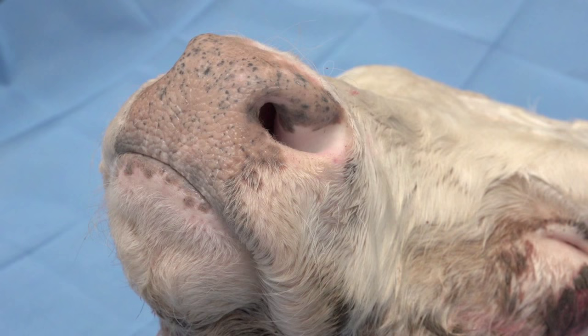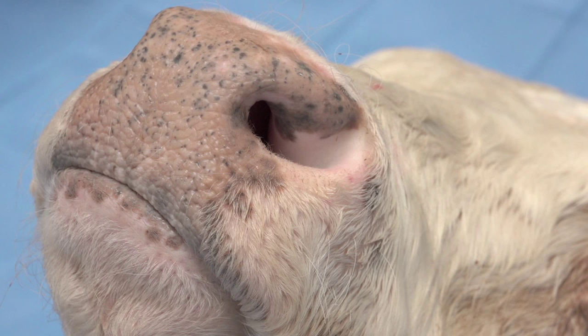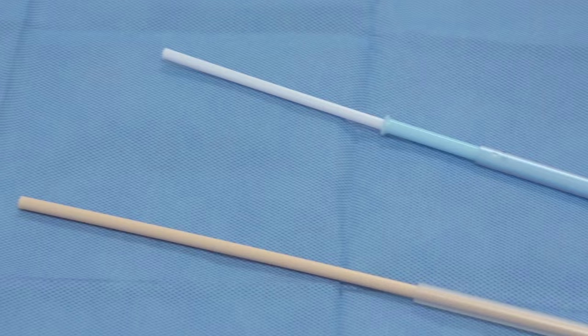This demonstration, while videoed using a cadaver, is meant to be performed on live animals. The goal for upper respiratory diagnostics is to collect a representative sample from the upper respiratory tract that is distant from areas of possible contamination. Samples taken from the nares are typically not representative of resident organisms in the respiratory tract.